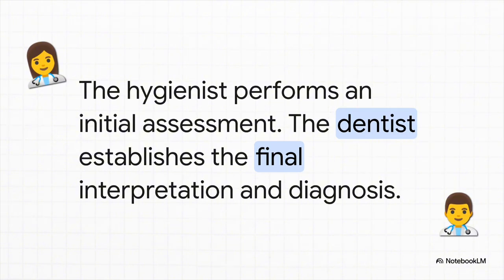And you know, this whole process is a real team effort. Your dental hygienist is an expert at capturing and assembling these images, and they can do an initial assessment. But the final, official interpretation and diagnosis, the part where they tell you what it all means for your health, that is the responsibility of the dentist.